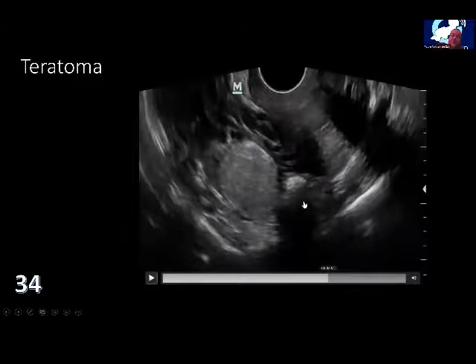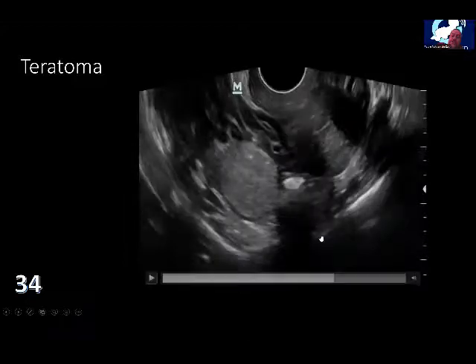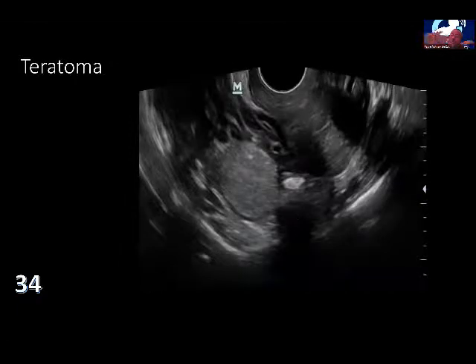I'll show you. Right spot, more solid, which shows some shadowing. The better your device is, the lesser the odds of having the shadowing. So the definition of stones by the shadowing is not always good.